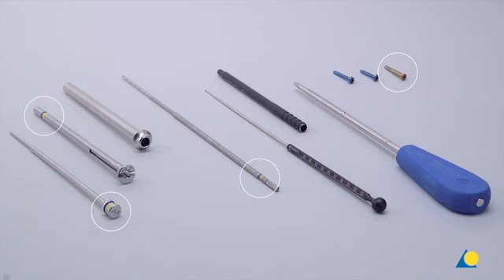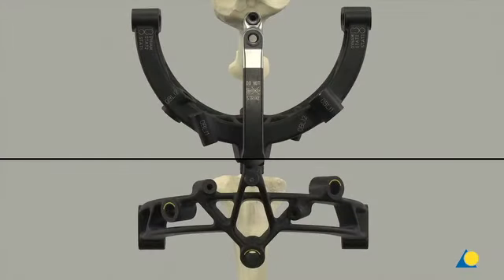The gold cancellous bone locking screw is only used in combination with the two oblique proximal locking holes in the aiming arm, labelled oblique 1 and oblique 2, or the AP proximal locking hole. The aiming arm can be used to target all three oblique locking options. The oblique locking option labelled oblique 1 corresponds to the most proximal locking position. Inserting an end cap with this locking screw will create a fixed angle construct. This is the option demonstrated in this exercise.